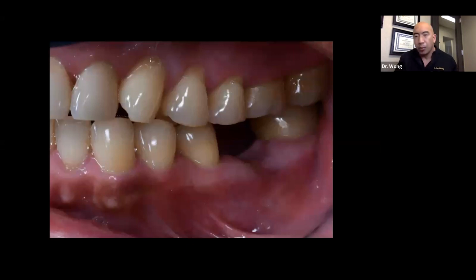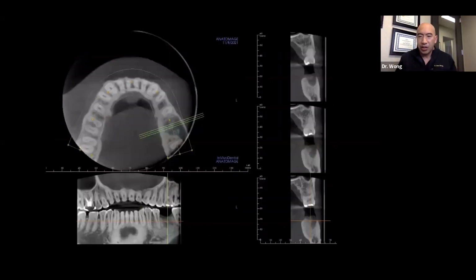So what's the problem? The problem is when you take a CBCT, you can see there where that root used to be. It has not filled in with bone. So try putting in your implant perfectly and getting good stability. I mean, it can be done, don't get me wrong, but clearly that patient is still going to need additional bone graft placed, and we still need to have a membrane and some soft tissue management there.